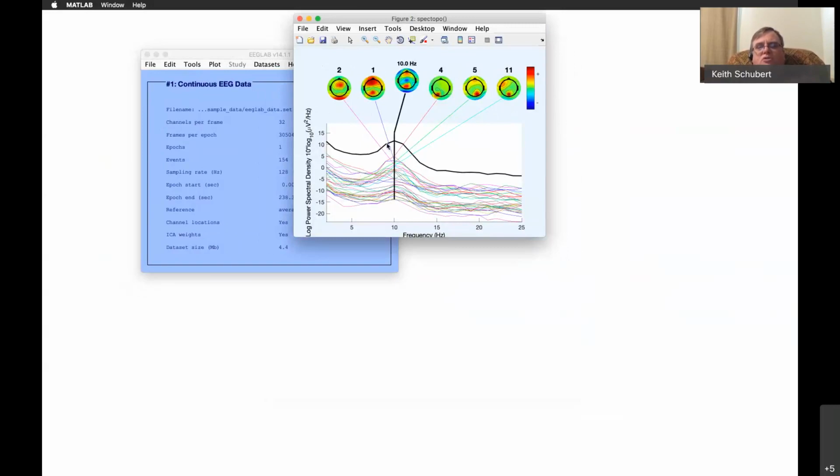So you'll see it's the same type of plot, but now I'm doing it for the individual components as opposed to the channels. The components are what you get out of the ICA. So now I can look at the individual components from ICA and see where they fit on the curve. Do they fit the same thing? I can see this particular component that's here, what does it get? And it's drawing the lines to the individual one.